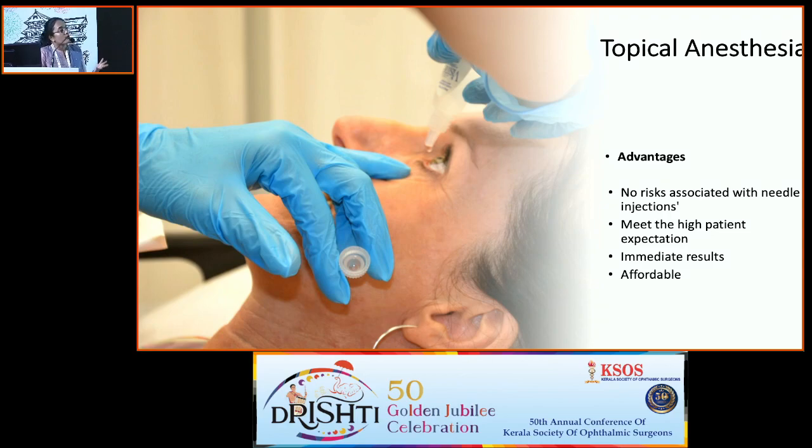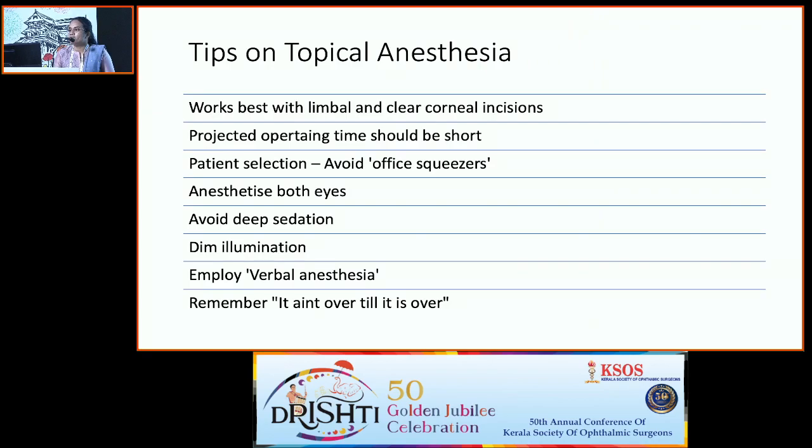Now, with the advent of safer phacoemulsification systems, smaller incisions and foldable IOLs, cataract surgeons are shifting their focus to topical anesthesia. There is absolutely no risk associated with needle injection. It also meets high patient expectations: no downtime, immediate results, and very affordable.